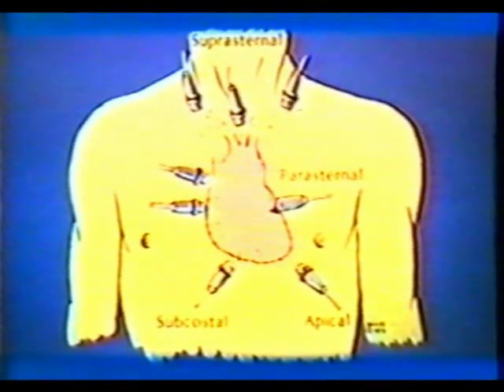When performing the Doppler examination, we arrive at a low value for theta by selecting a transducer location that is on line with the stenotic jet, and then making very fine manipulations of the transducer in all directions until the maximum velocity is obtained. For aortic stenosis, where the jet can be quite eccentric, we further ensure a minimum value for theta by performing the examination from multiple transducer locations.